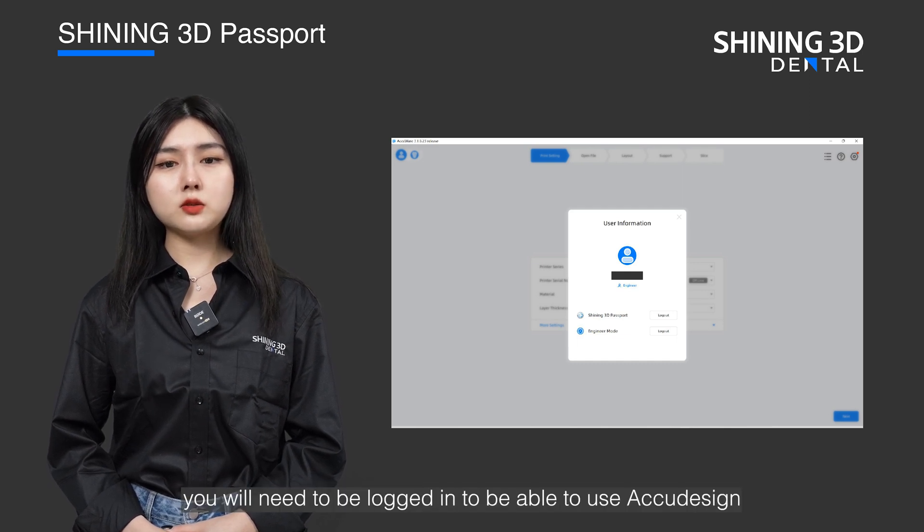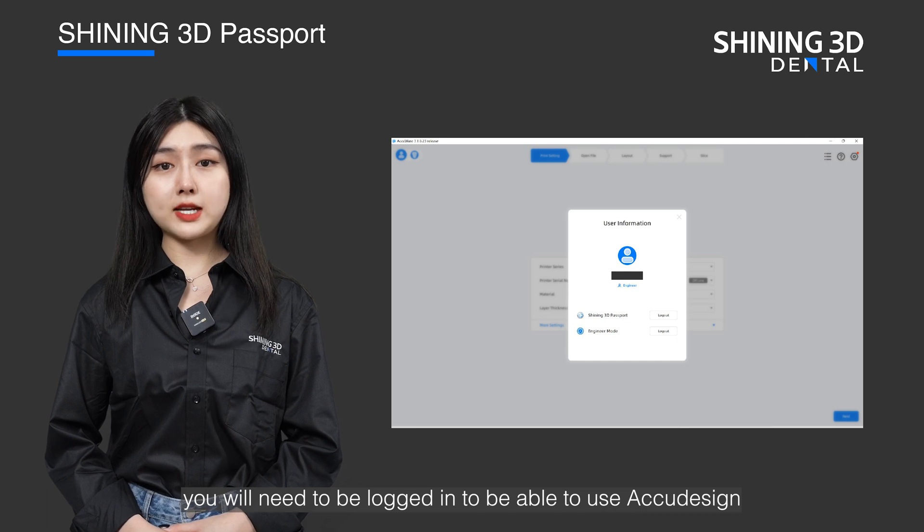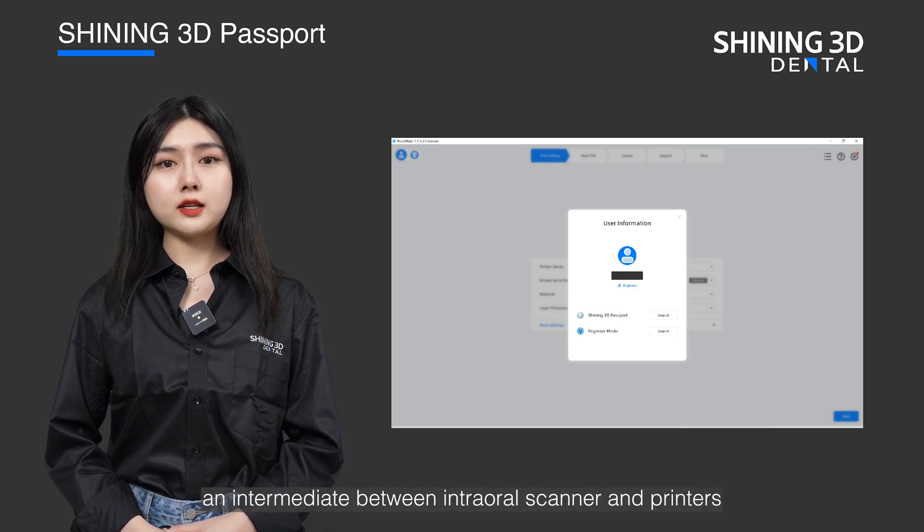You will also need to be logged in to be able to use AccuDesign, which is the design software and intermediate between the intraoral scanner and printers.